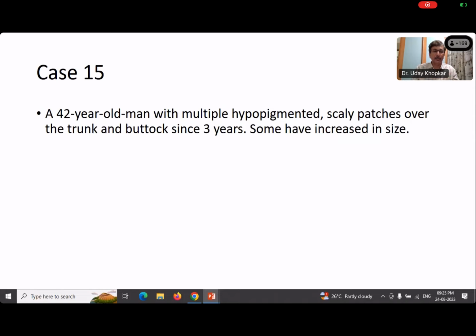Frequently, both the conditions, systemic as well as localized scleroderma, tend to get biopsied in the atrophic phase. Because the condition is asymptomatic, patients present late in the disease, and so it ends up being in the atrophic phase. So, you may not see the classical boxing of the dermis every time.